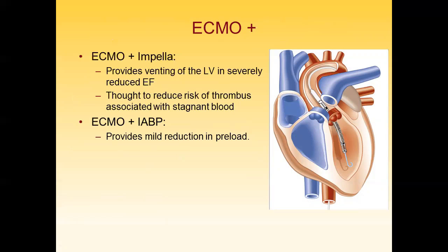Question: when you go from ECMO to a permanent VAD or BiVAD, do you have to go onto cardiopulmonary bypass, or can the surgeons go directly from ECMO to BiVAD? They can go to a temporary BiVAD, like an RVAD, LVAD system. Do they have to use cardiopulmonary bypass? ECMO is cardiopulmonary bypass, and they use peripheral ECMO in ORs. So no, they don't need a step in between.